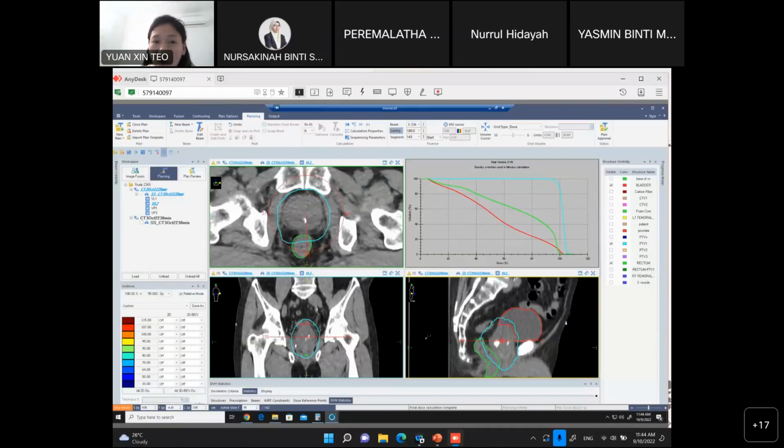So for example, okay, this one, why do I say it's very important? I can show you another case. This case. Okay, as you can see here, we have 2 scans. For this patient, I have 2 scans. Bladder volume, we scan at 20 minutes and 30 minutes. Okay, so I can show you the difference.